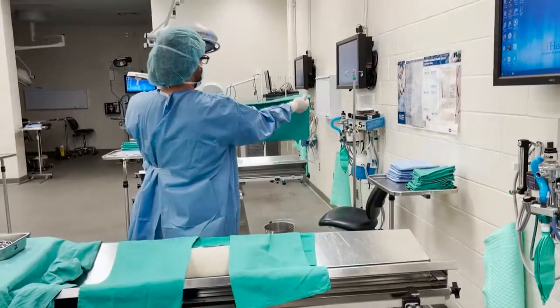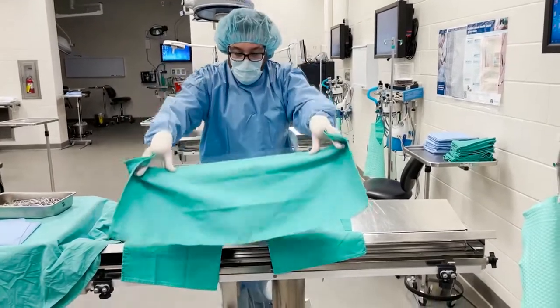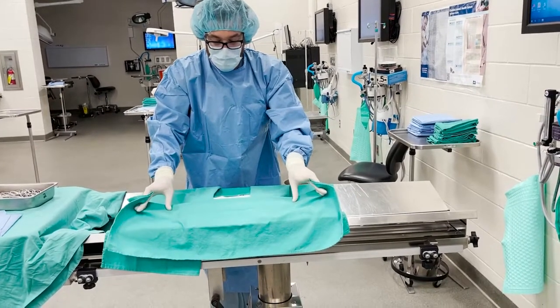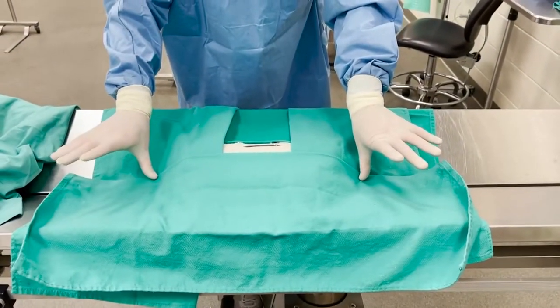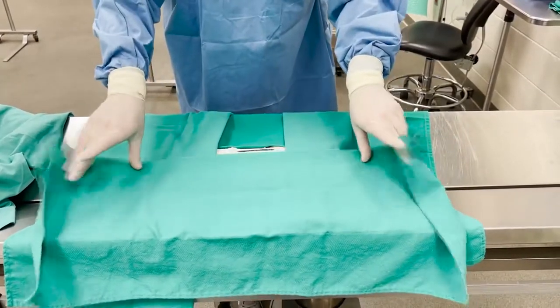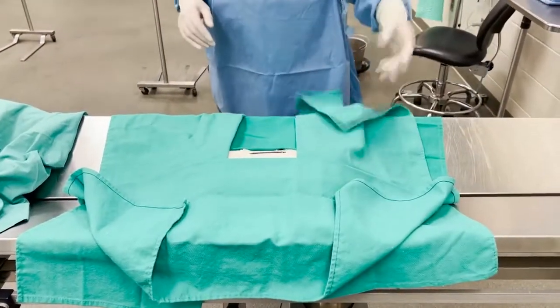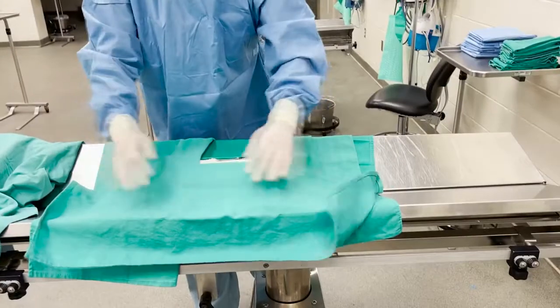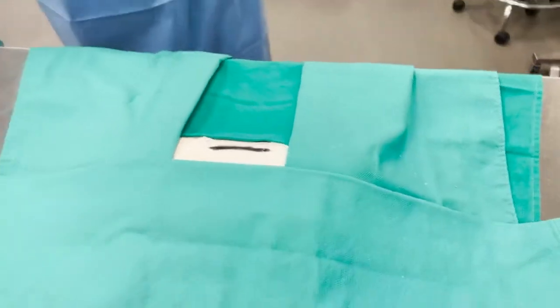Pinch, little hammock, curl, fold, and give it a little flap. Bring it straight to where you want it, use your thumbs pointing downward, and just let go of your fingers. You don't want to rotate out and touch dirty stuff — just release. It doesn't matter if the edges aren't perfectly folded since you're going to put a drape over this, so don't worry about fixing it. As long as the incision area looks good, you're good.